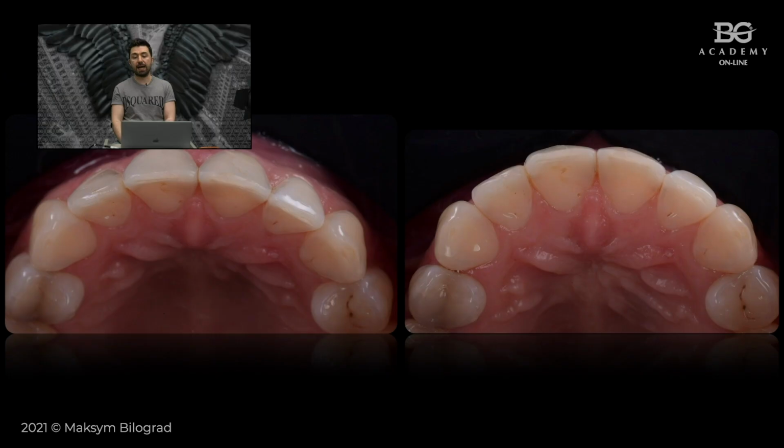We go to this slide, and this is actually the protocol for direct restorations. We take frontal pictures, lateral views, and also some pictures from the incisal edge. The picture from the incisal edge is pretty important. This one actually shows you the difference in level between enamel and composite, right? That view also has to be used during the layering process, because during layering you'll be able to determine if you placed enough composite, or you have to add, or you have to remove. So that will help you to see so-called dimensions.